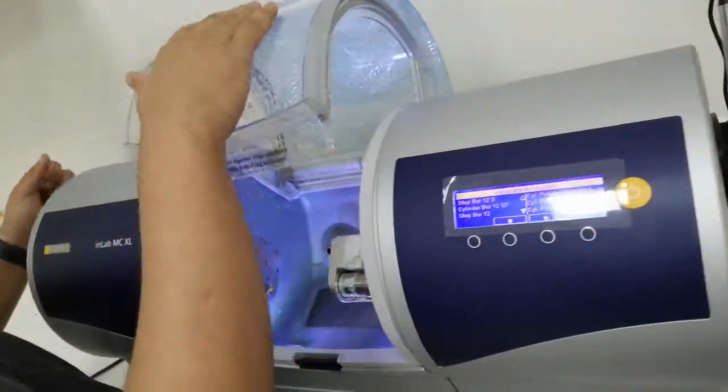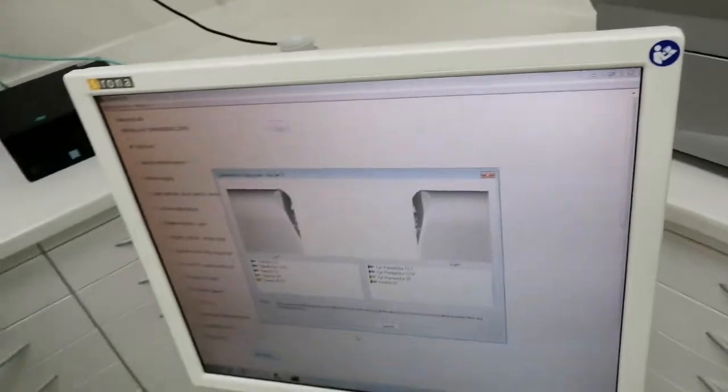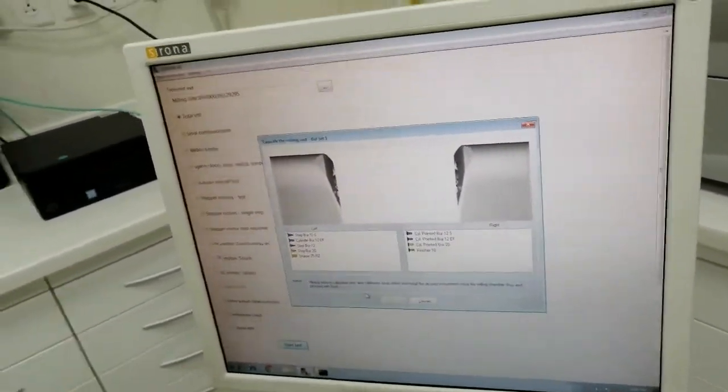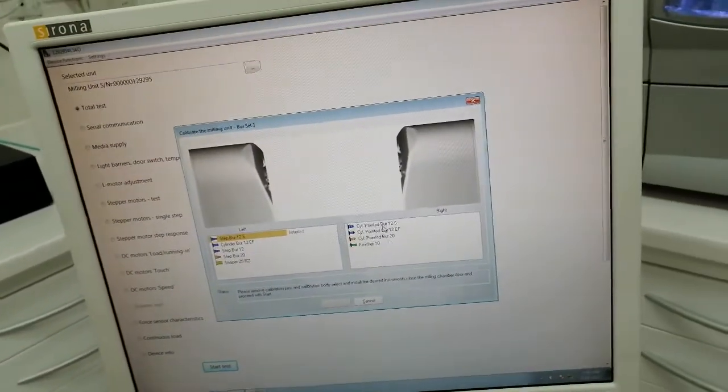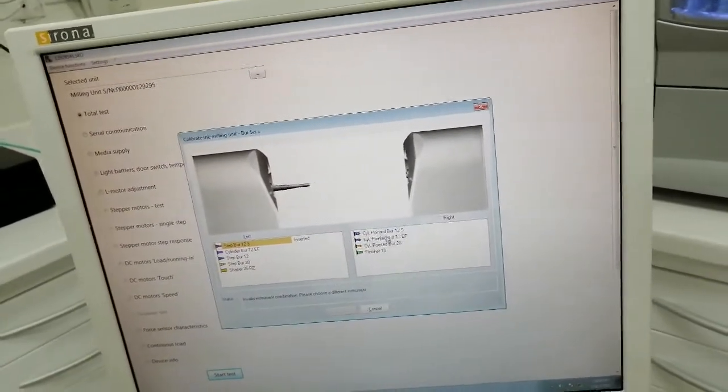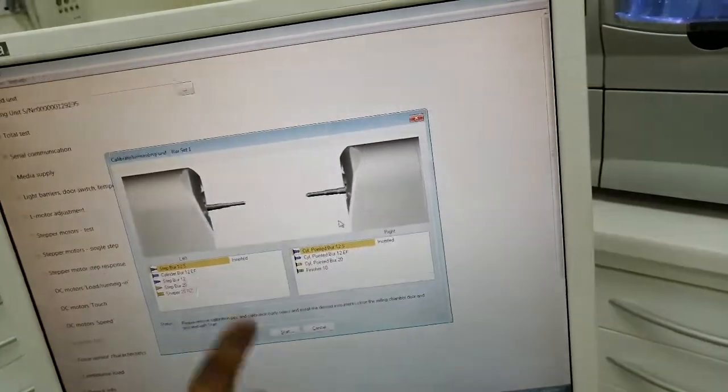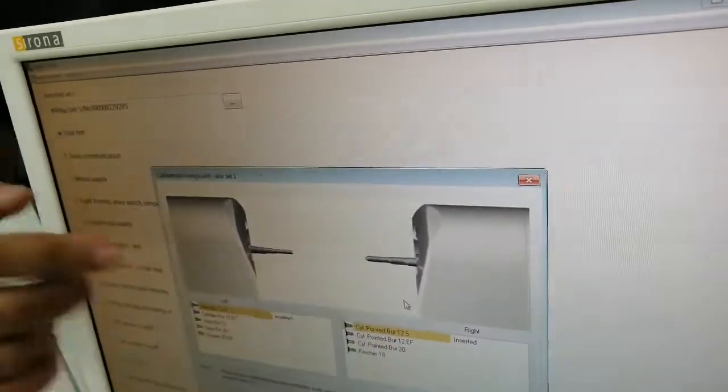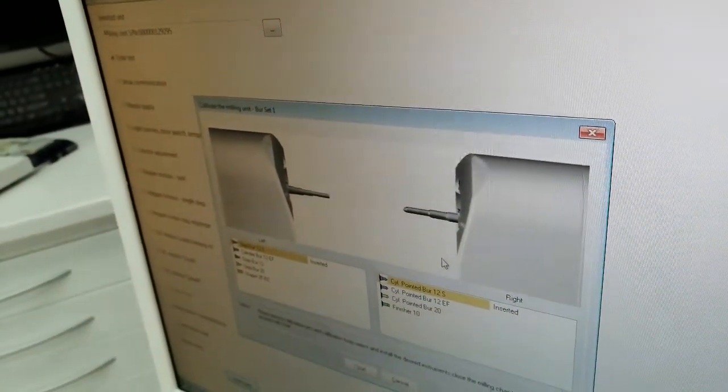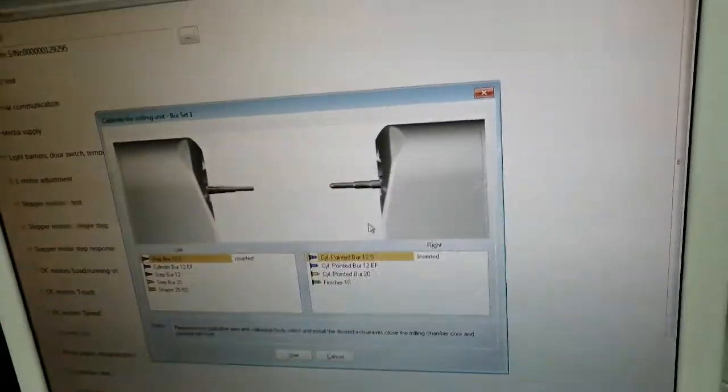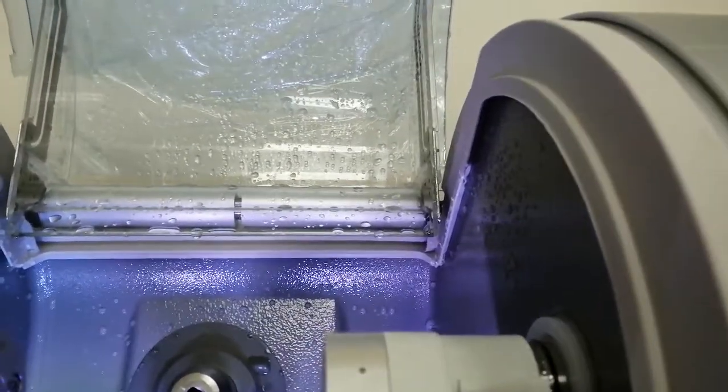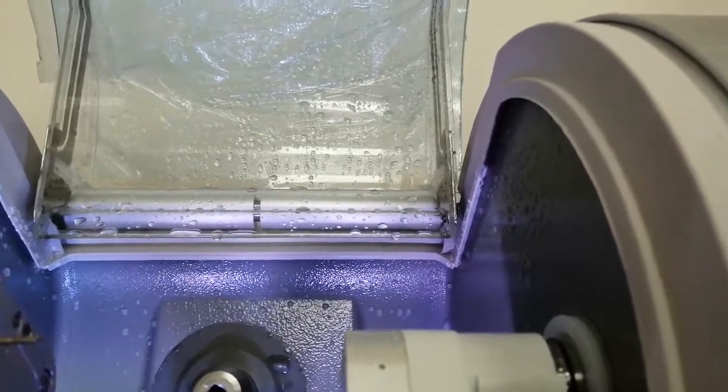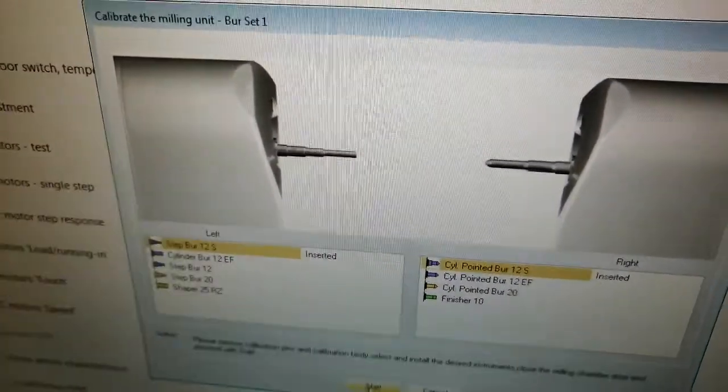We have one more step to choose the type of the bars. From here I select step bar 12S on the left, and pointed 12 on the right. Check the shape here and here with your eyes. It's the same - one, two, three. Here one, two. Here step is cylindrical. Compare them. Same? Yes. Press start.